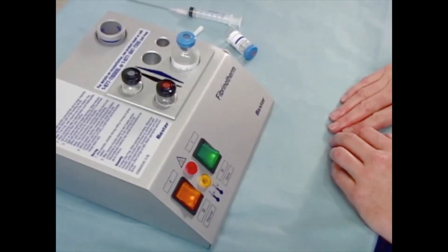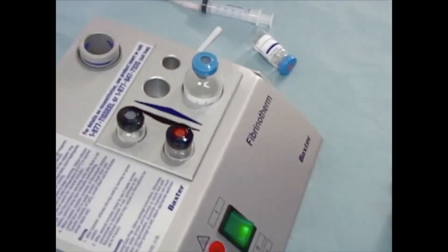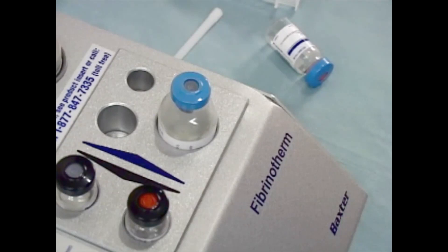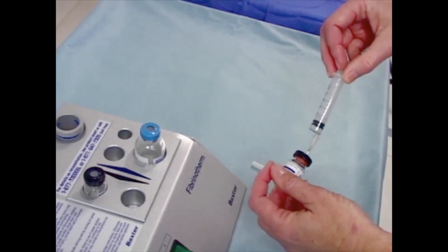Allow the vial contents to stir until the sealer protein is fully dissolved. While the sealer protein solution is mixing, go ahead and prepare the thrombin solution. Remember, to prevent premature product activation, do not use the syringe previously used with the sealer protein solution. Using the black-scaled syringe, withdraw all the calcium chloride solution.